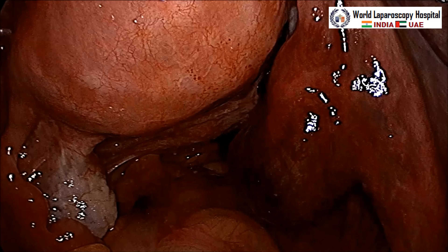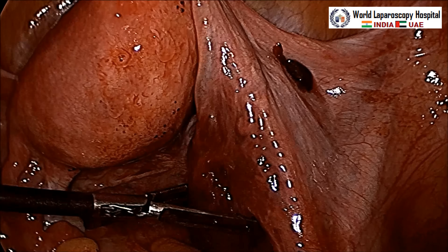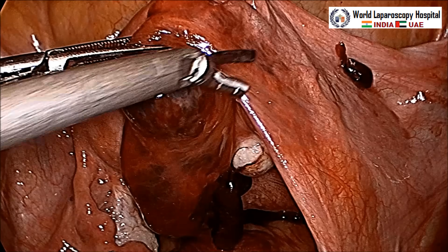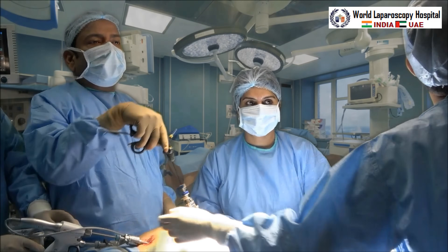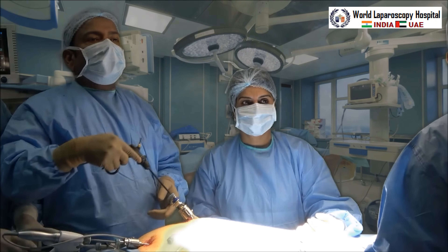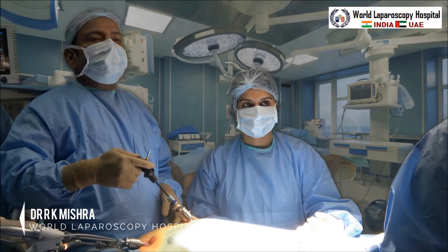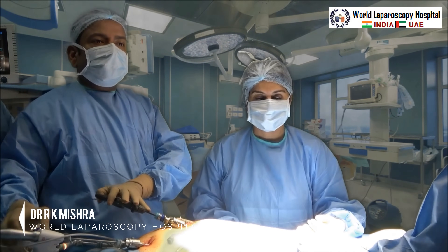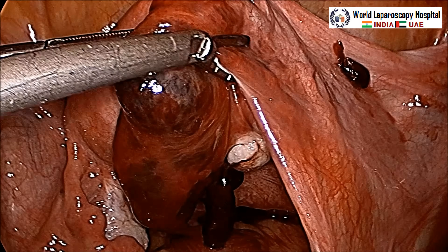Tachycardia is still 120. Oxygen saturation is fine. In this situation you should be faster — the faster you work, the better the prognosis for these patients. We can see this is the right-sided ruptured ampullary pregnancy. Hold it with a grasper and give anteromedial traction — anteromedial traction toward the anterior abdominal wall and medially. With the left hand hold the grasper, and with the right hand using the harmonic device, start cutting the tube.